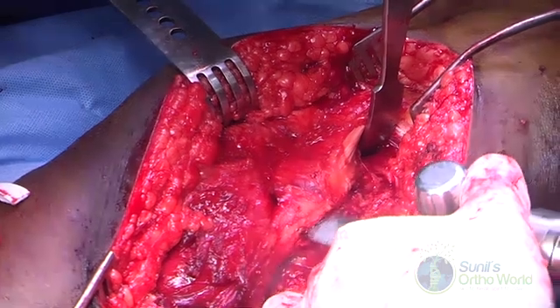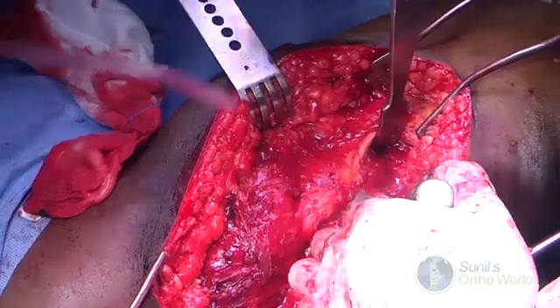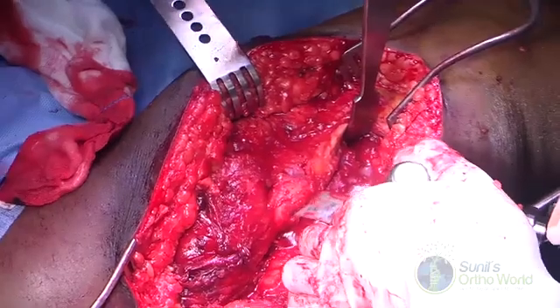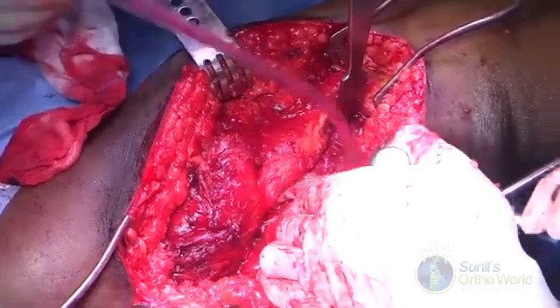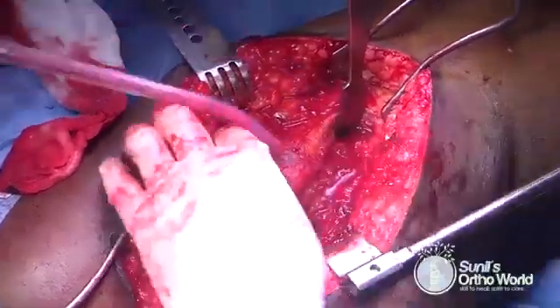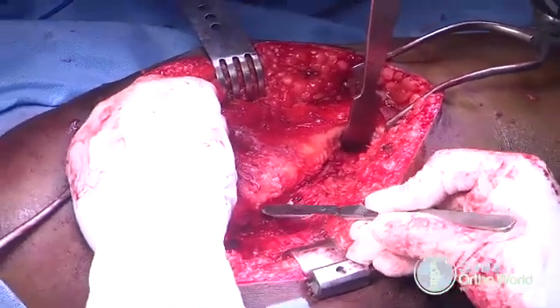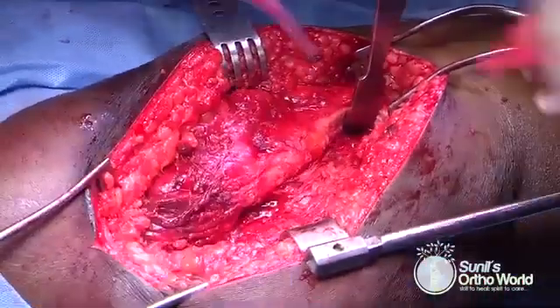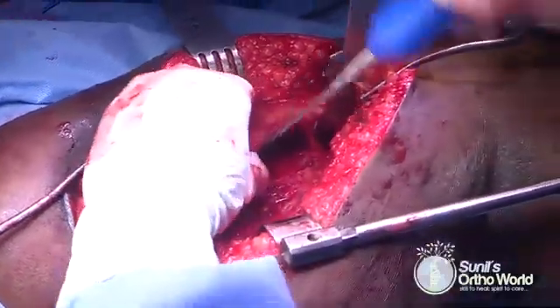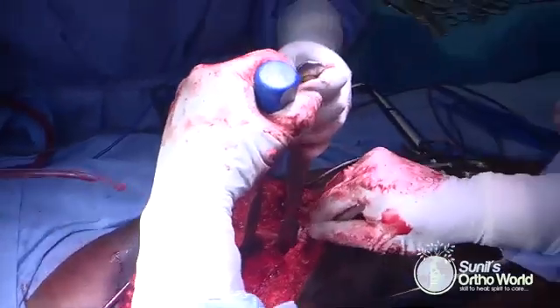An oscillating saw is used for this purpose and the osteotomy measures around 1 to 1.5 cm in thickness. If the surgeon requires more stability at the osteotomy site, the straight cut can be modified into a step cut technique. Once the osteotomy is completed, the remaining posterior fibers of the gluteus medius muscle are sharply elevated. The osteotomized trochanteric fragment containing the insertion of gluteus medius and vastus lateralis muscle is then gently lifted off and reflected anteriorly.